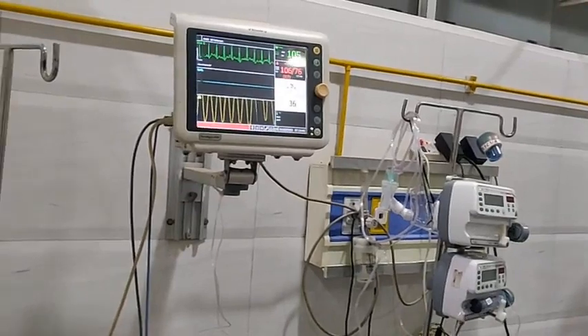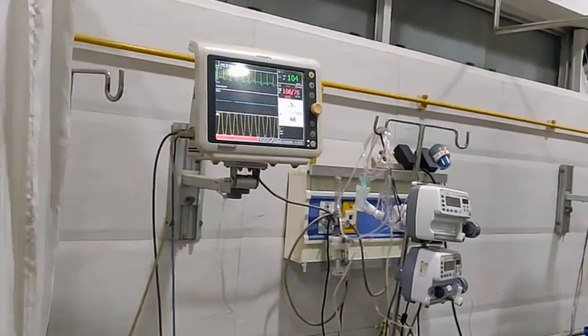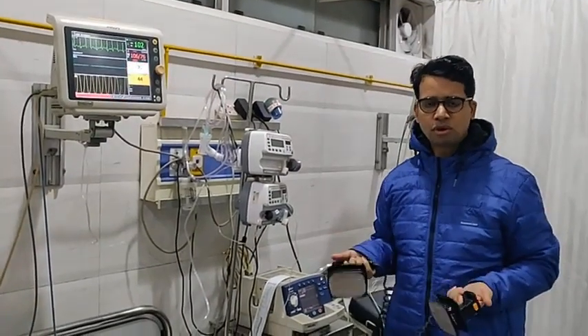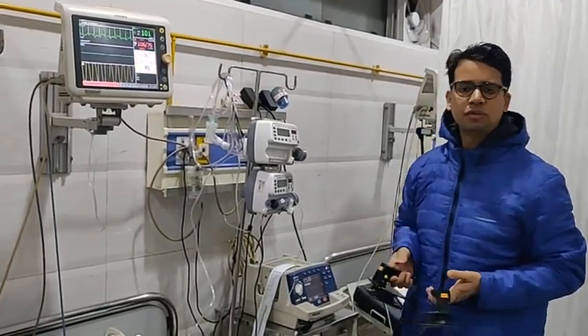The heart rate is 105, so it is completely reverted. You can see how safe and beautiful this treatment is. For the whole night the patient was in trouble — we were trying with amiodarone and many other drugs, but this was unsuccessful. Only 30 seconds of work can do wonders for the patient.